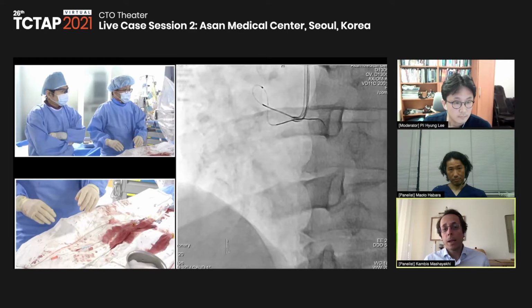For sure, if you fail and end up, let's say, in a subintimal space there, you have to think about the side branches. One side branch connection is the proximal side branch, going from the right marginal branch to the distal right marginal branch. It's an ipsilateral channel. I don't personally think that this is a very important side branch in terms of RV function, but there is also a very nice, huge collateral, the big right marginal branch collateral. This should be preserved if possible, for sure.